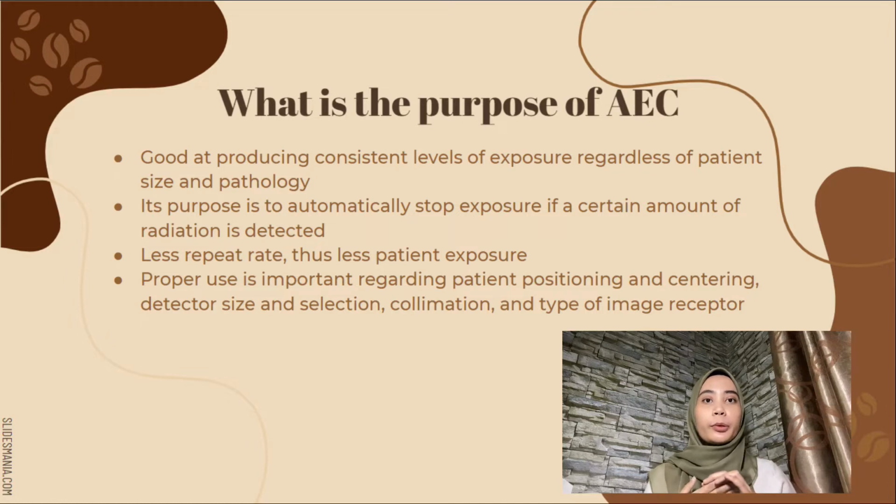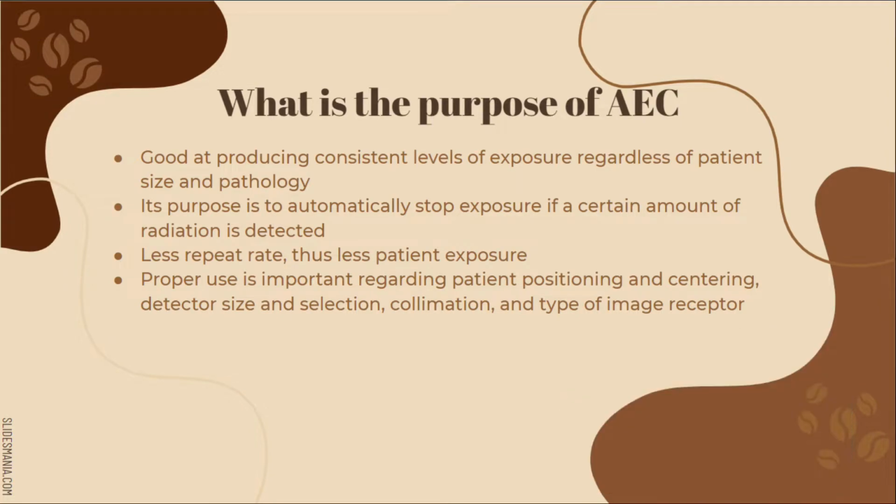We need to know that fewer repeats cause less patient exposure. It's also important to use proper steps regarding patient position and centering, detector size and selection, collimation, and also the type of image receptor itself.